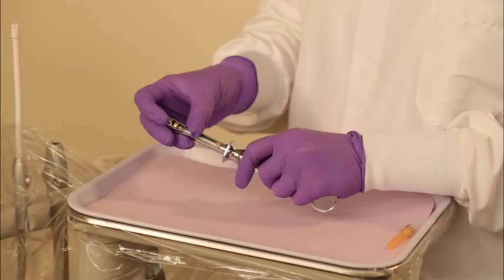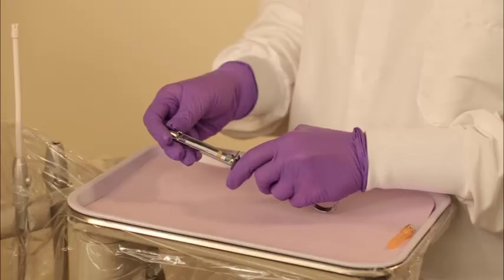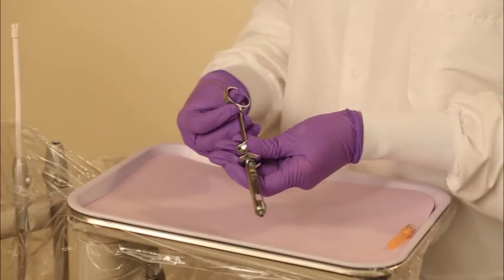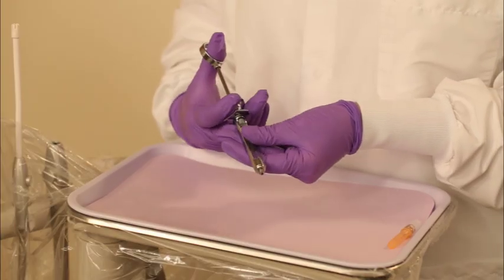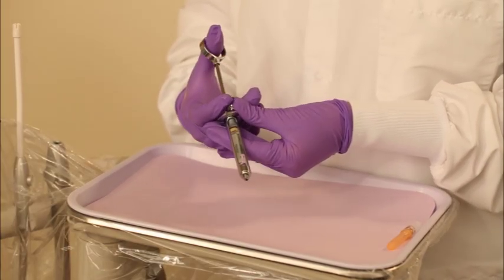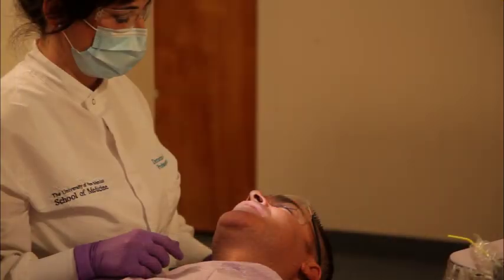Load the local anesthetic syringe as demonstrated in the procedure, loading the metallic or plastic cartridge type syringe. Before injection, follow all steps as demonstrated in the procedure, basic injection technique. Assume the correct operator position for a right-handed clinician at 8 o'clock right side or 9 o'clock left side, or a left-handed clinician at 4 o'clock right side or 3 o'clock left side.